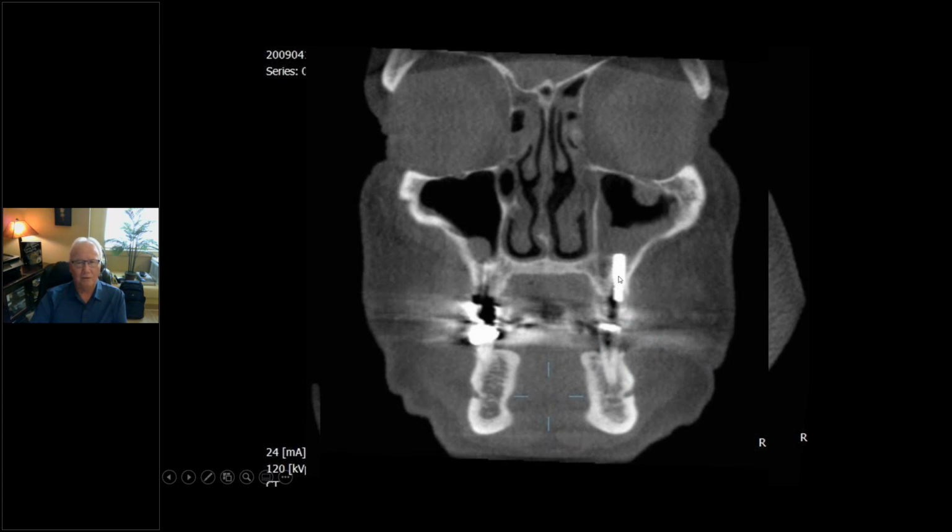If you put a foreign object, I don't care if you think you did a beautiful sinus lift, it shouldn't be in there. And this inflammatory change is not going to go away. If the patient has lots of signs, symptoms, and other problems, they're going to blame you. "Doc, I can't breathe. I got a runny nose all the time. My implant's loose. I can't have relations with my wife because my breath stinks from all the sinus changes." Well, he probably already had sinus changes, but you didn't make it any better, so you get blamed.